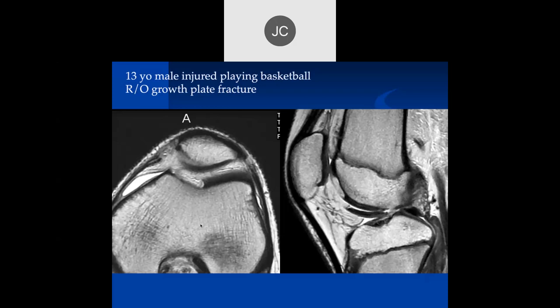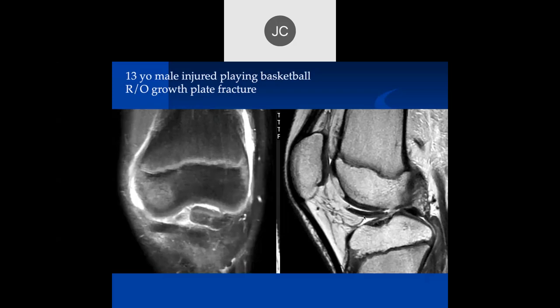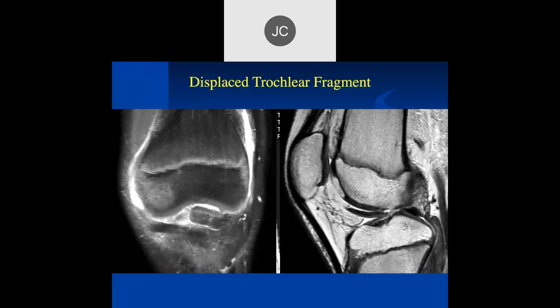13-year-old male injured playing basketball. At the medial trochlea, transitioning to central, there's a large area of cartilage loss and it looks like it's displaced inferiorly. If you see a big defect in the cartilage with sharp margins and the underlying bone looks pretty normal, this is very typical of an acute injury. Then you have to look for the displaced fragment — and that's the displaced fragment right there. On coronal images, we can see some bone edema in the subchondral bone where impaction occurred.